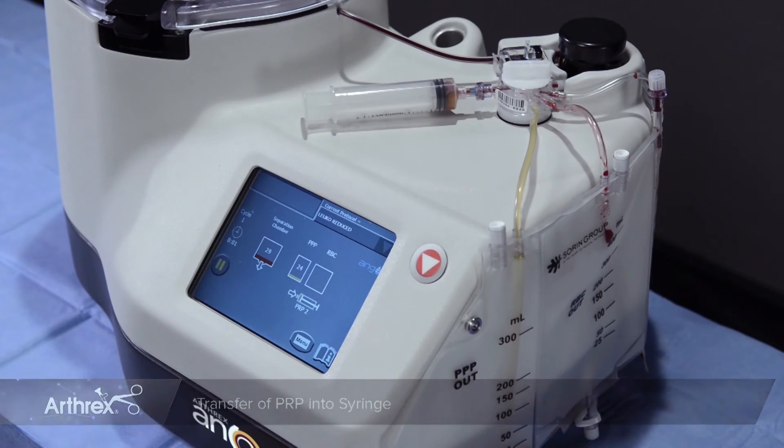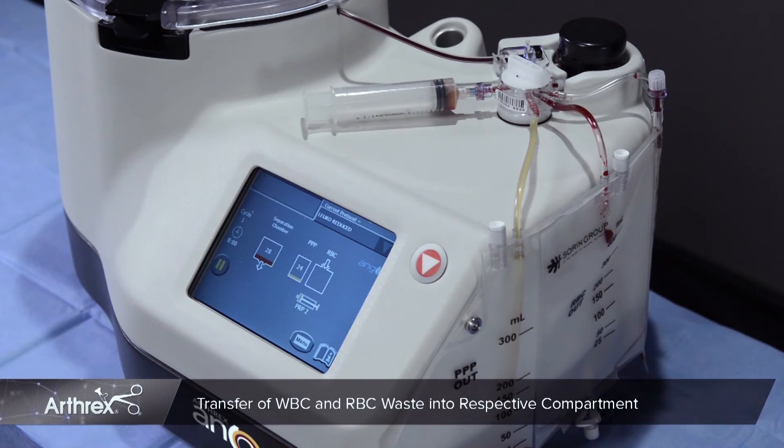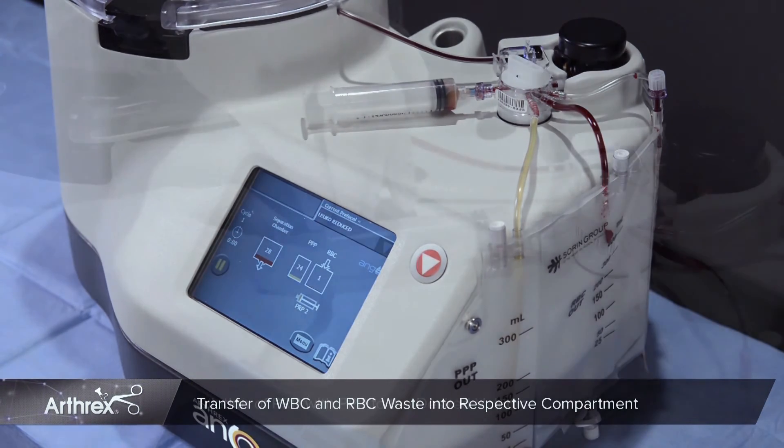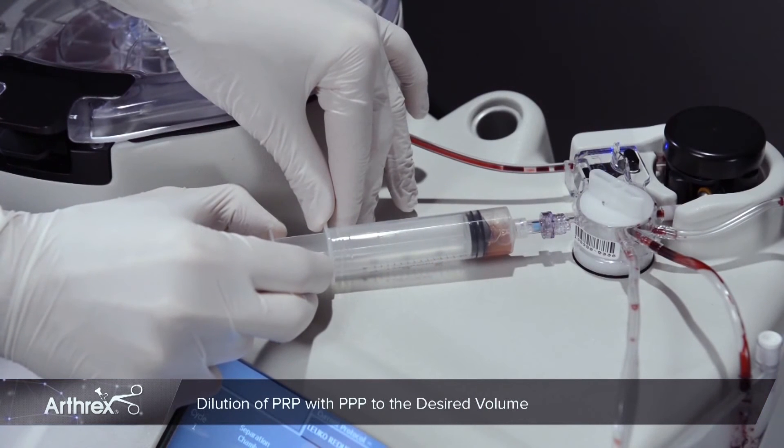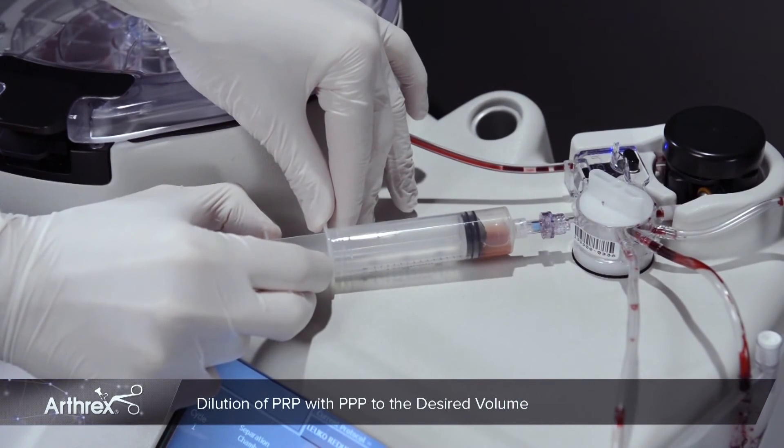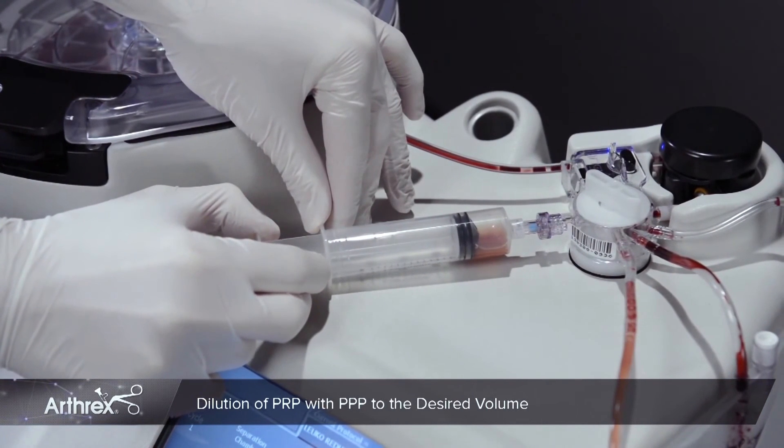If a concentrated PRP is desired, the PRP syringe may be disconnected. To increase the volume of the PRP syringe by diluting with PPP, simply pull back on the syringe plunger.